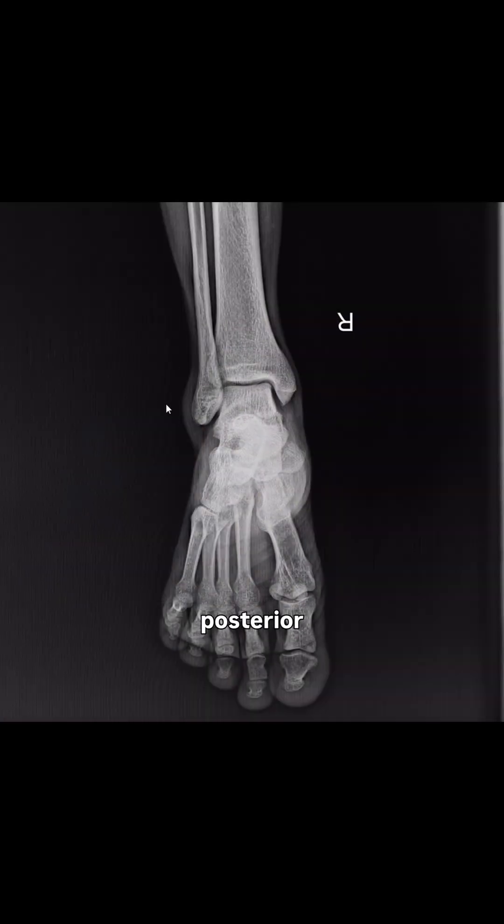This is how I read ankle X-rays in my OBD. But before looking for fractures, it is important to understand what a normal X-ray looks like. Here we go — this is the anteroposterior view of the ankle joint.